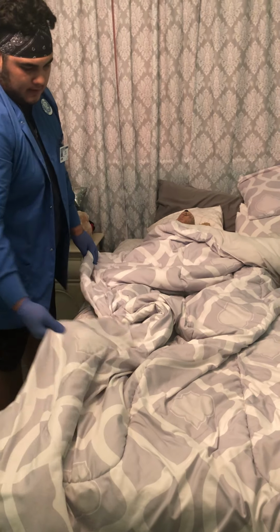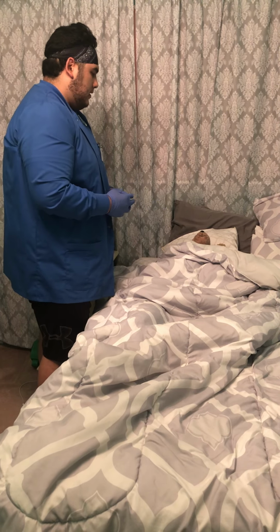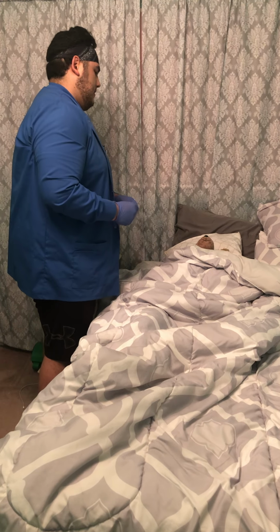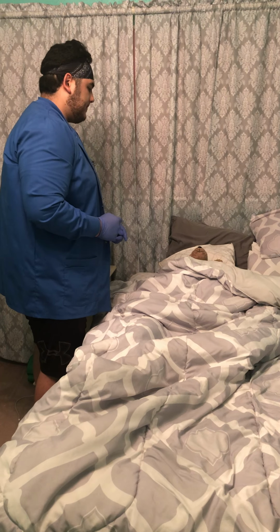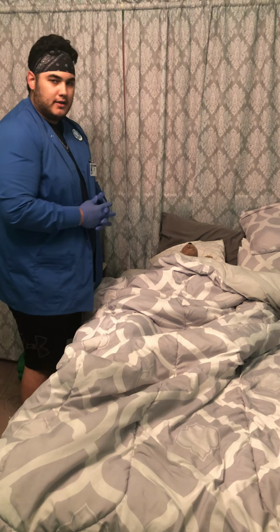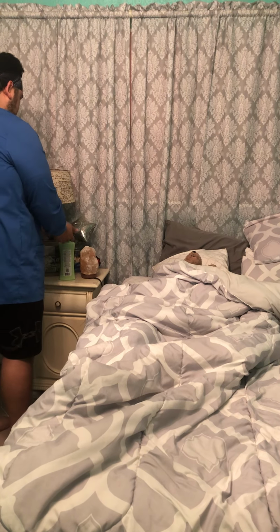And so that is how you insert a Foley catheter into a female patient. Alright, so that was that. Are you in a comfortable position? Yes. Alright, so we're going to go ahead and make sure the bed is locked and lowered. We got two side rails up. And then, place the call light, just make sure the patient doesn't need anything before we leave, and then we're done. And so we're gonna take these gloves off and then perform hand hygiene before we leave. And that is that.